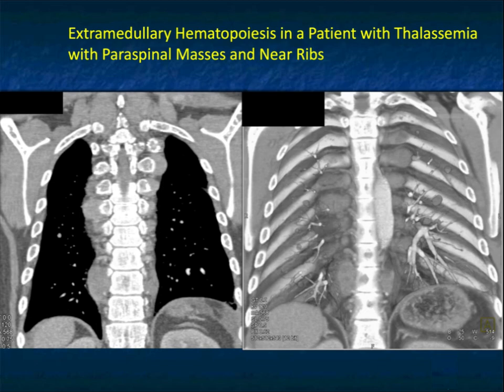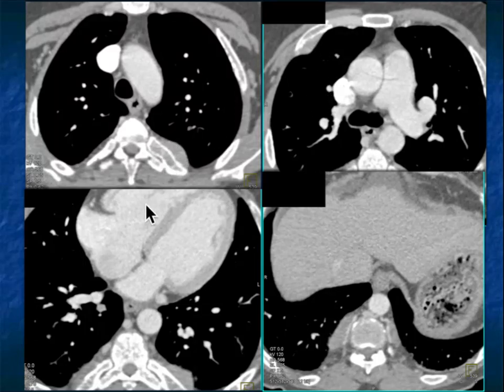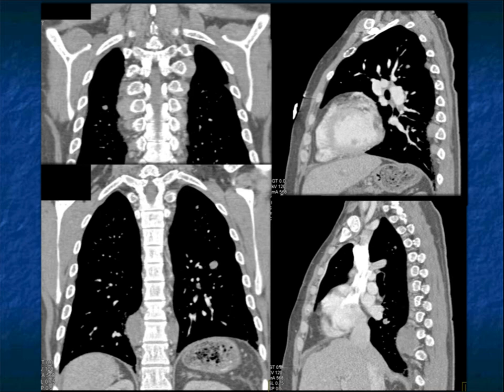Here's a nice example — look at those lobulated masses on the coronal and 3D coronal views. Bilateral, almost symmetric, very extensive — you can see why you would think about lymphoma. Another example at four different levels shows extramedullary hematopoiesis by the ribs and in the paraspinal regions. Not as bulky as the last case, but extensive, with notable lobulations — here's another example with paraspinal involvement.